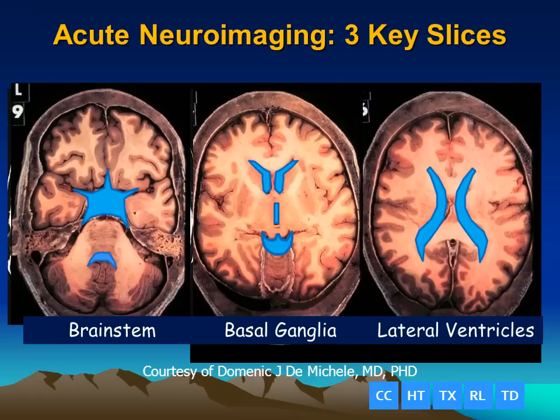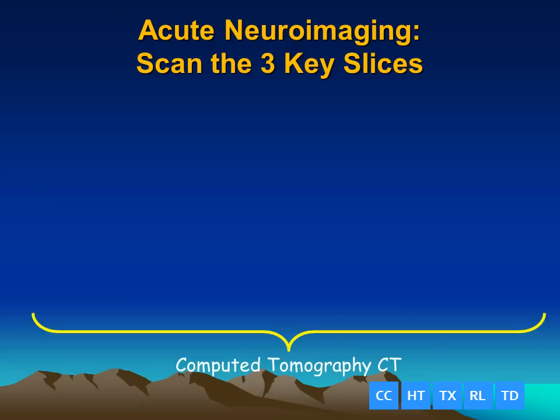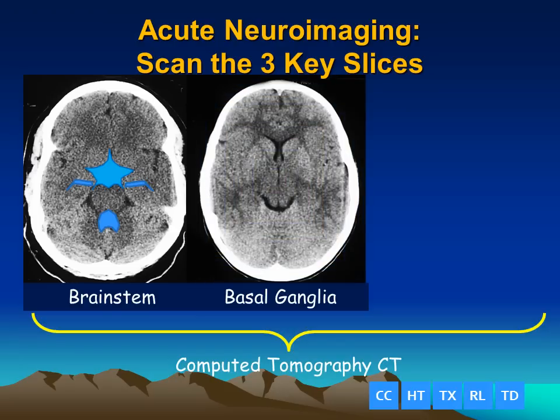And then higher up, we see the lateral ventricles, and their midline should be in the midline of the patient. If we look at corresponding CT scans, we can see the star shape of the suprasellar cistern, we can see the temporal horns of the lateral ventricle, and the fourth ventricle.